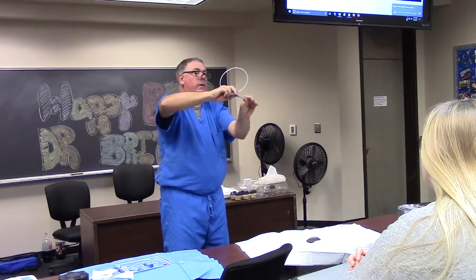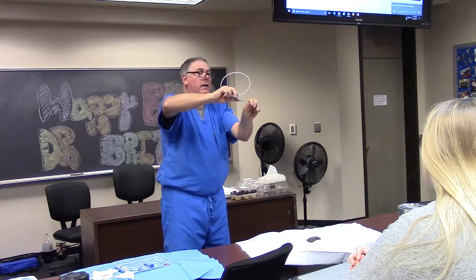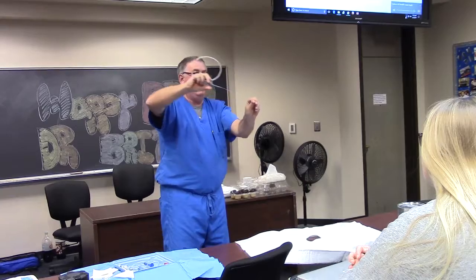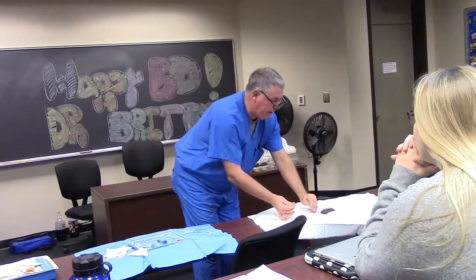So now that we're in properly, what we're going to do is pull it back till we see the wire, grab the wire, and just pull it off. Now, you've got the wire. What did I say about the wire? Never let go of the wire. So now you're inside. All we've got to do is take the introducer needle and back it out like that. So we're inside the vein now.